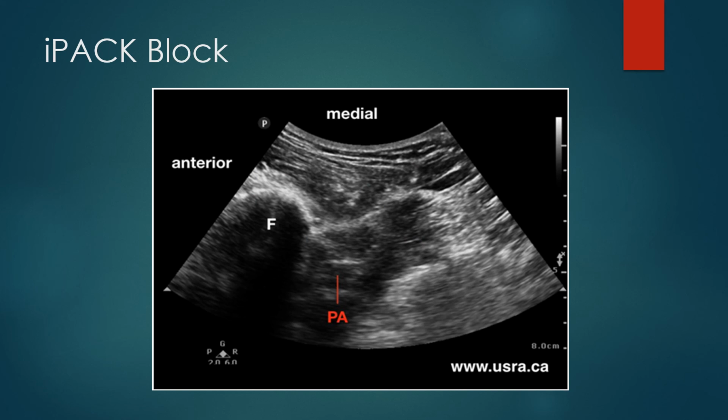This ultrasound image shows the femur. This is with the transducer, which is obviously curvilinear here, placed on the vastus medialis muscle, and the needle would be brought through the muscle, skirting along the femoral cortex, and come to lie between the femoral cortex, the back of the femur in this instance, because this is an anteromedial position, and the popliteal artery. So the local anesthetic would be deposited in this region.